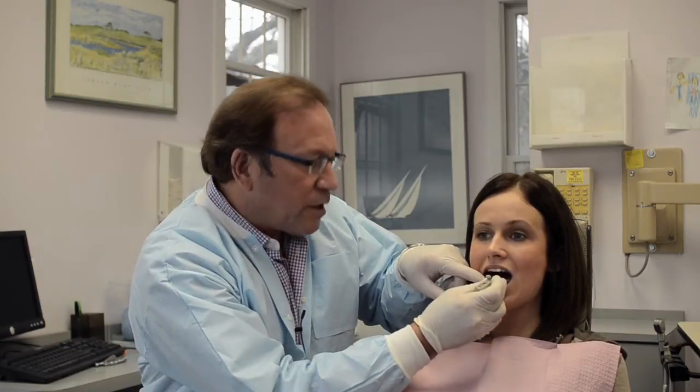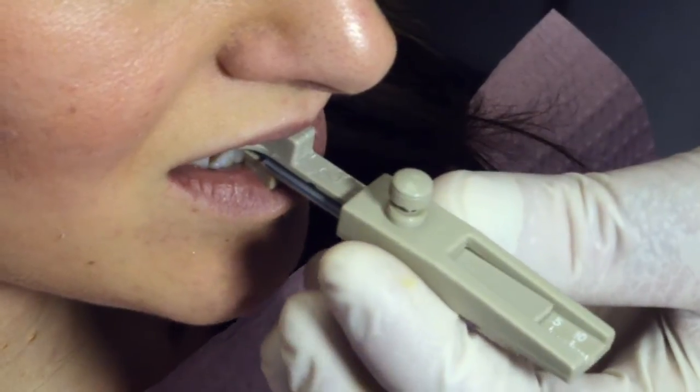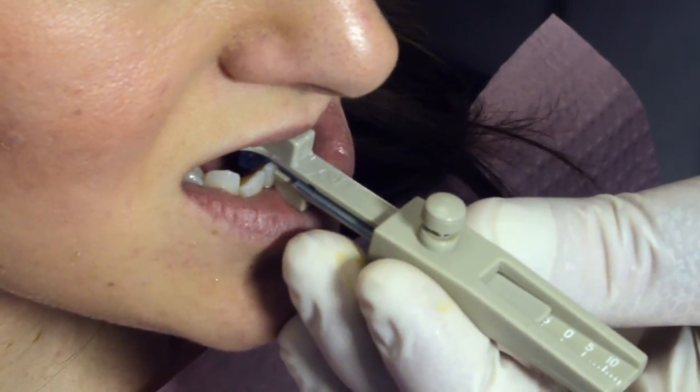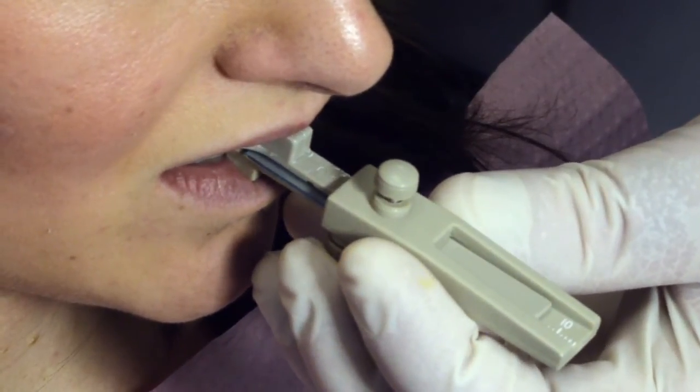So we're going to ask Sarah to close down into that notch. And now I'm going to ask her to move all the way forward with the lower jaw, and I see +5, and all the way back, and that goes to a -5. That's a 10 millimeter range of motion.